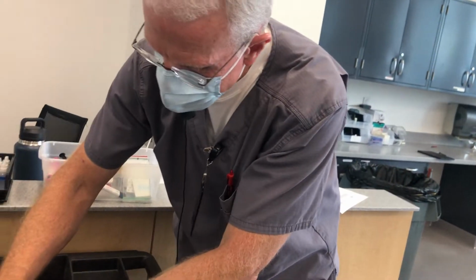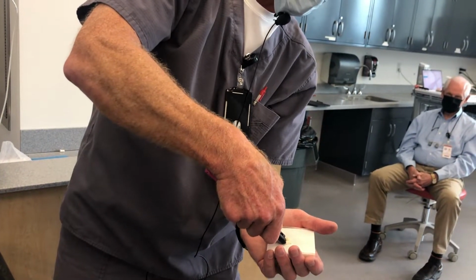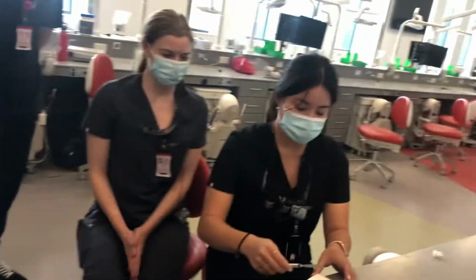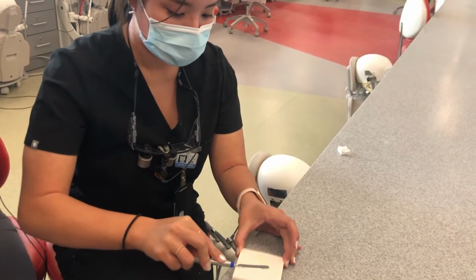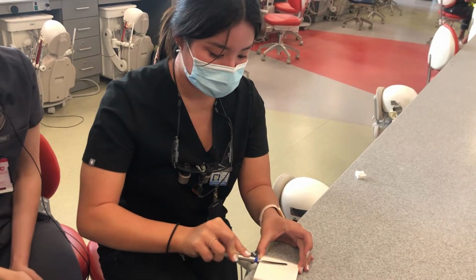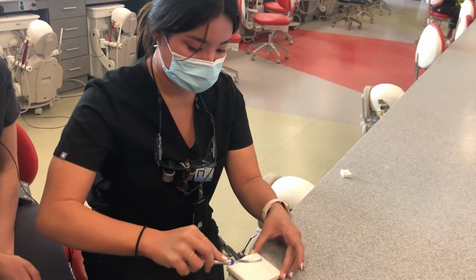Should we have them race? Yeah, okay, here we go. I'm gonna do it double because that's really how much you'll mix. Here you go. Go, Emma, go! Show us how to mix. She knows how to do this. So 20 seconds, rapid. She's good, going really rapid. It's almost like she has an unfair advantage. It's almost like she knows.